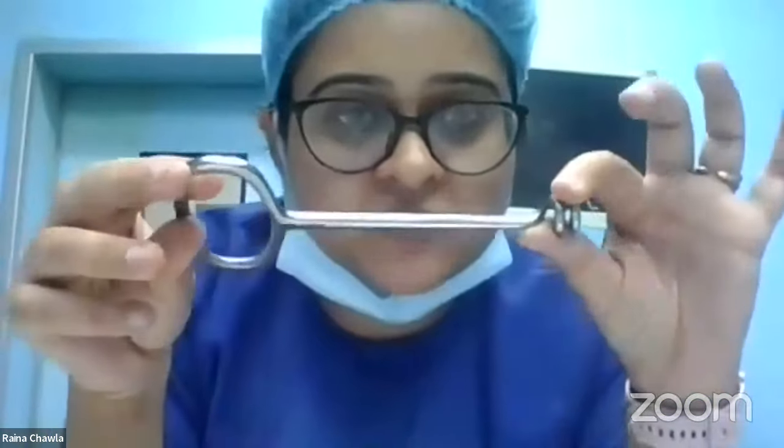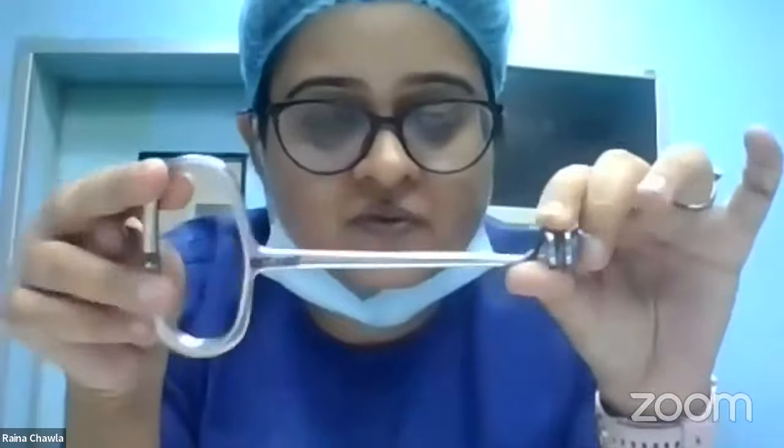All right, so this is a myoma screw, and we have the equivalent in laparoscopic instruments also. We have a laparoscopic myoma screw also. This is the myoma screw used in open myomectomies, for fibroid uteruses.